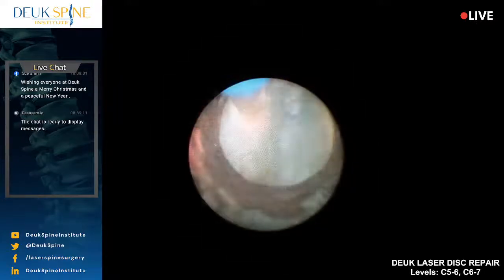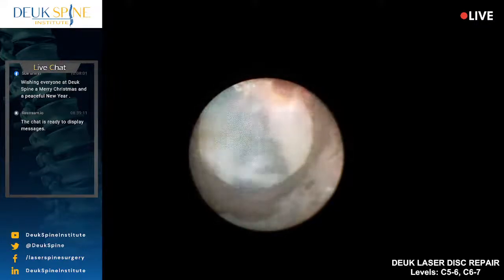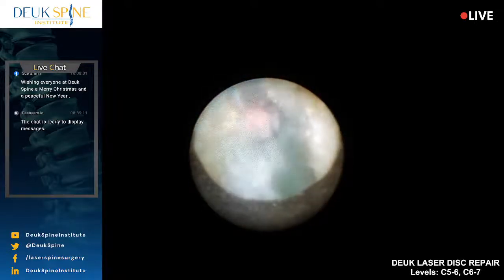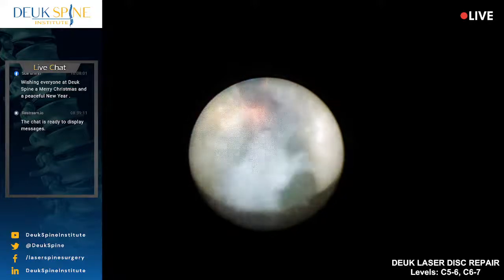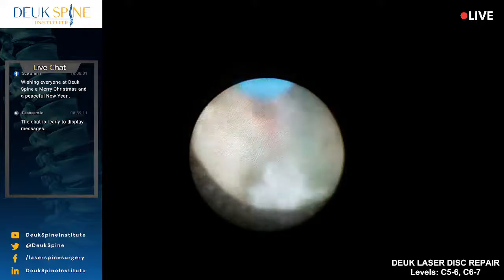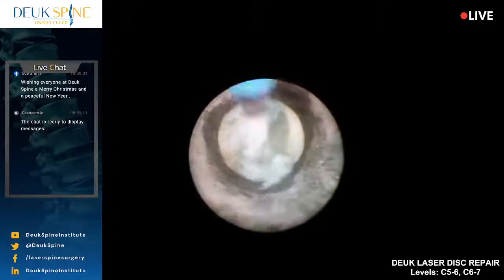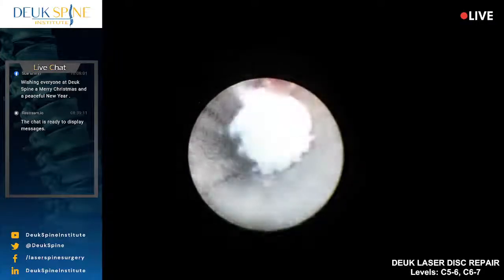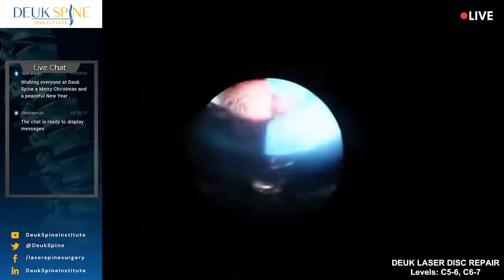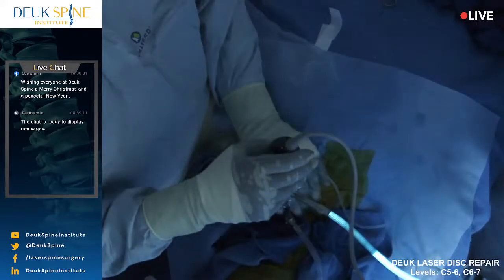Now compare that to a fusion or an artificial disc where they get 100 milliliters of blood loss, 200 milliliters of blood loss. Look at the beautiful view. We're now looking in his left foramen, okay, the left foramen. And again, there's a herniation right there. And it's stuck down, causing chronic inflammation. And now I'm releasing it. There's another herniation right there. Come on out, buddy. That is a piece of herniated nucleus pulposus. Okay, that's what we're after. But that's a free fragment.